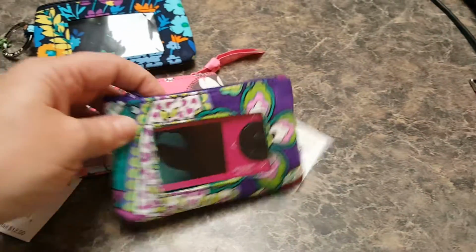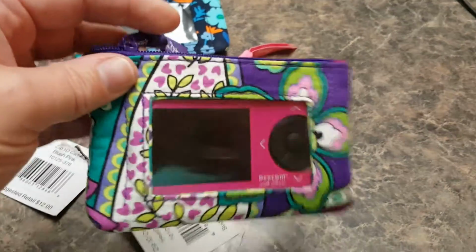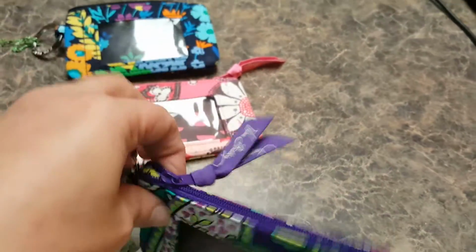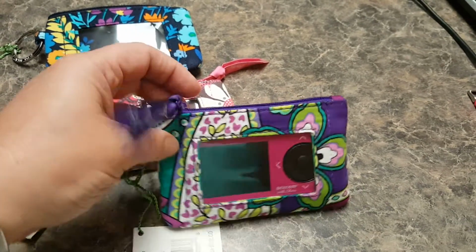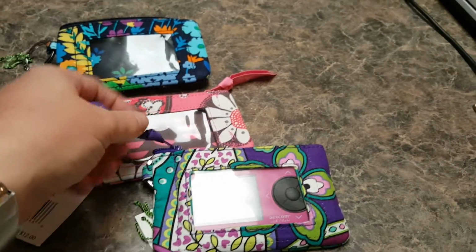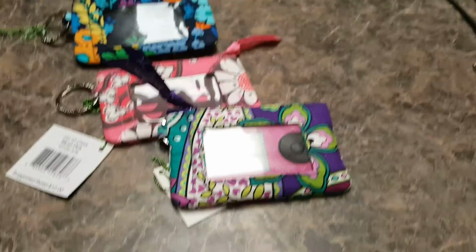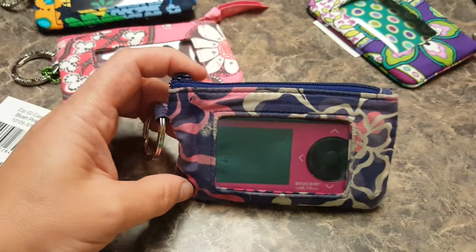I like to take just one seam out. When you take one seam out, it stays center, really stays in its place, and it's great. It's really in there. And I will show you what it looks like when we take the whole seam out.